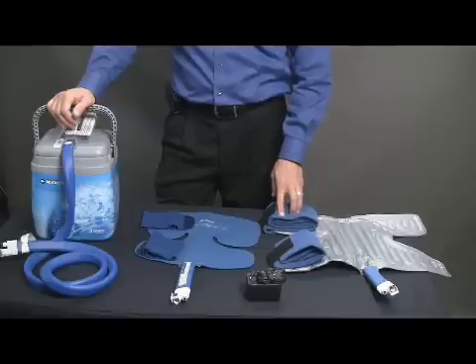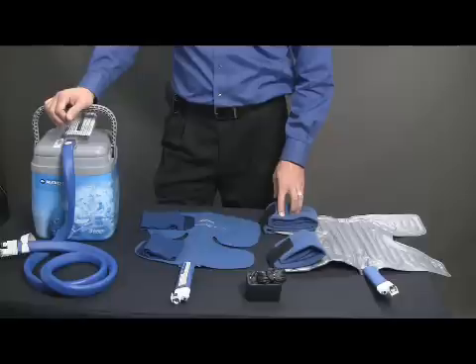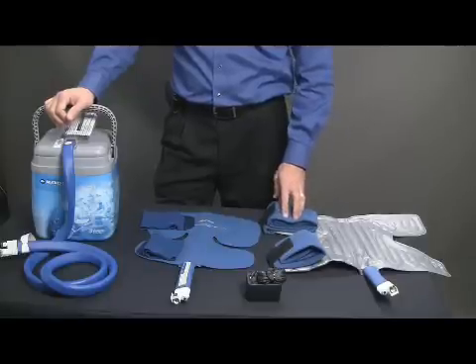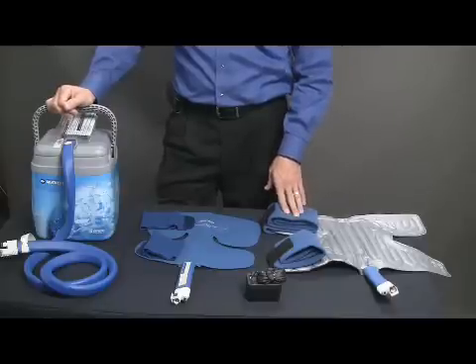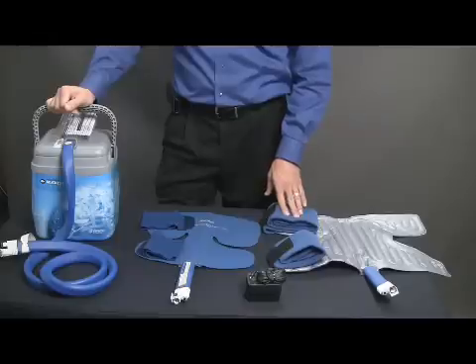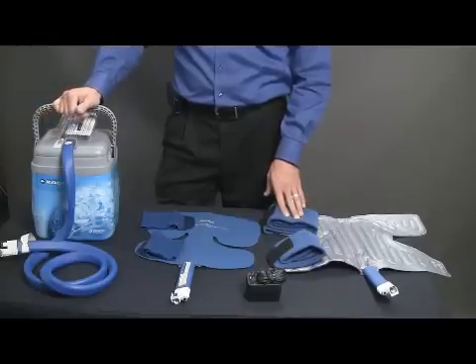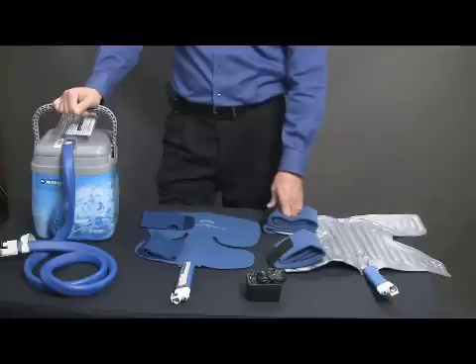Risk factors that would not necessarily exclude you from using a cold therapy device would be things such as excessive smoking or tobacco use, medications that have a negative effect on peripheral vascular circulation, or young children and the elderly population. And primarily because we want to make sure that when we're using a continuous cold therapy device that we have good circulation, especially in our extremities, but also that there's no communication barriers.